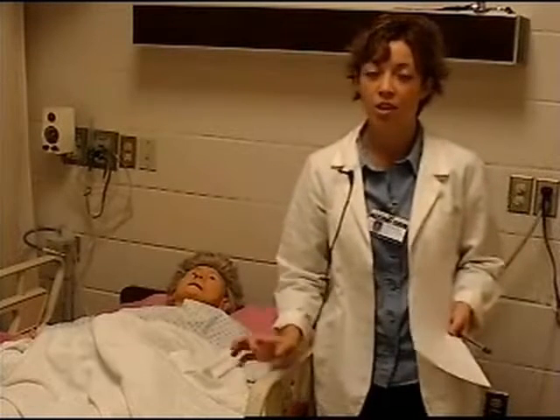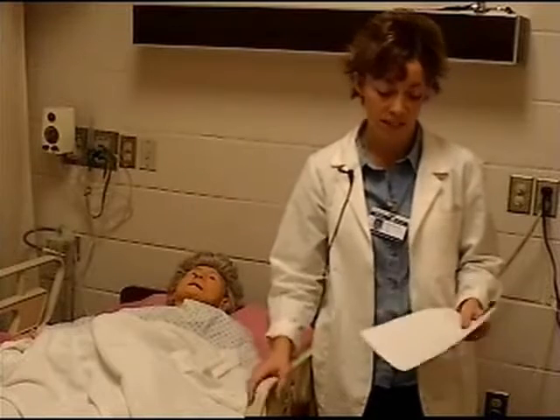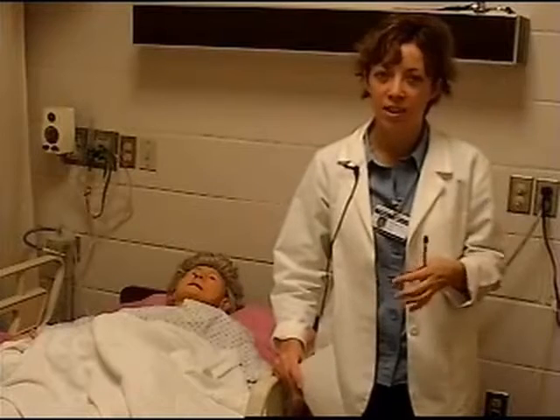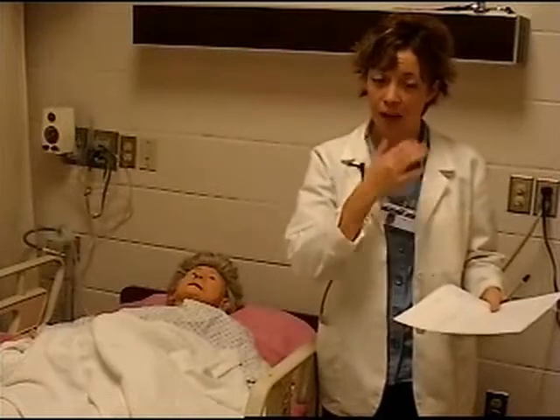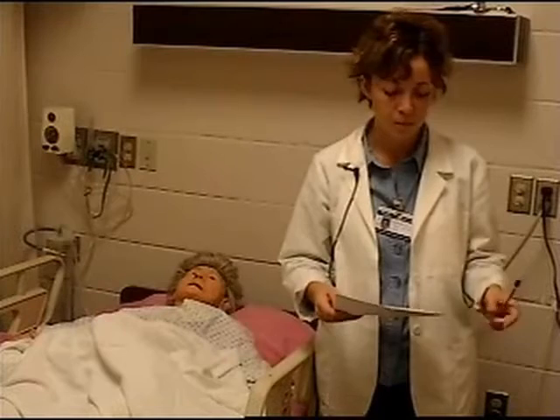This is inserted either by a surgeon or maybe a trauma doctor or an ER doctor that's had training in that. They used to have a 3-bottle system. I've never seen that. Pretty much places are doing what's called a pleural vac, and I'll show you that and we'll go through that. And that's a commercial type system.